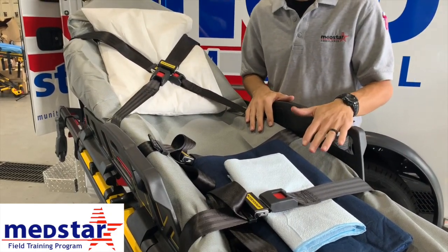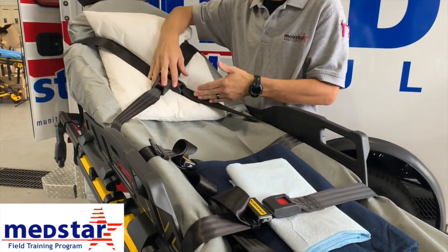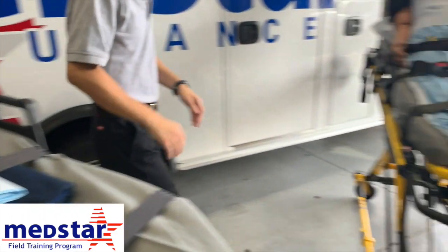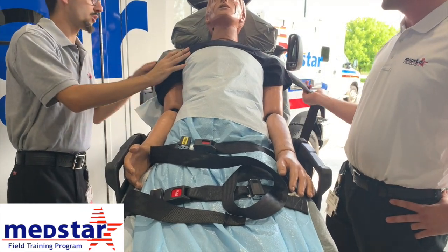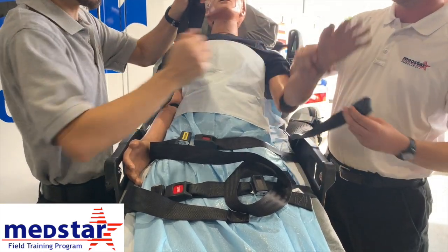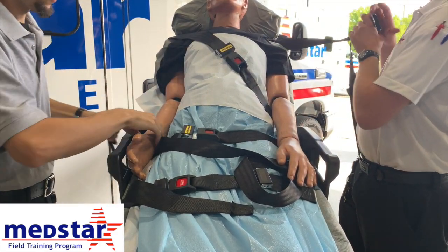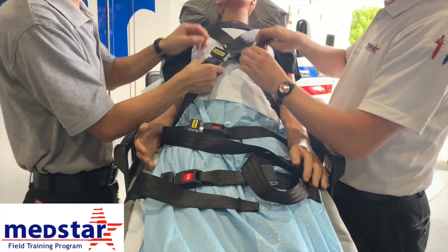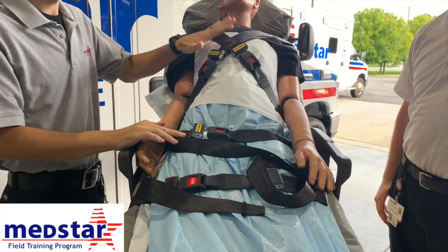With the Stryker Power Pro XT, we still have the 5-point restraint system, with the addition of what's called the X-Restraint — a new roller strap system. We still have our leg and hip harness. For the shoulder straps with the X-Restraint system, you go across the patient's chest onto the other side. Remember the seat belt should always go underneath the patient's arm. Your patient is then secured to the new stretcher using the 5-point restraint system with the X-Restraint.